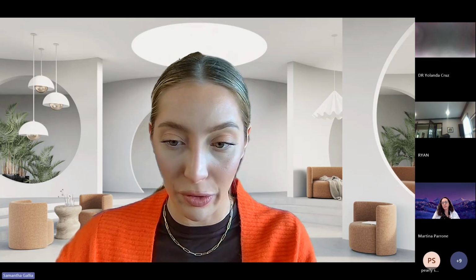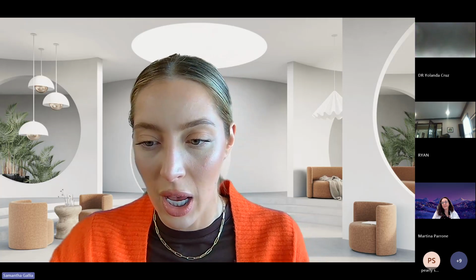So absolutely. I'm going to drop into the chat the name of the resource that I really like to use for anatomy. This is what we used in residency. If you want to get used to looking at the axial view, this is such a great resource. We got it for free in residency and I pay for it now because it's still such a great resource for me. So I'm going to drop that in the chat now.